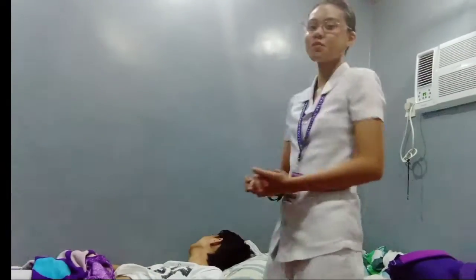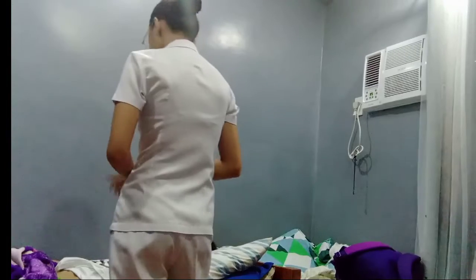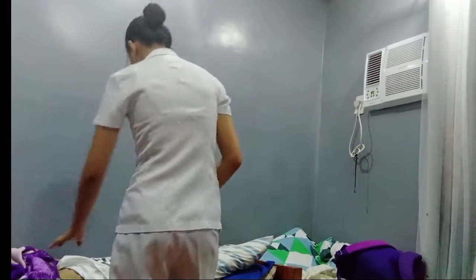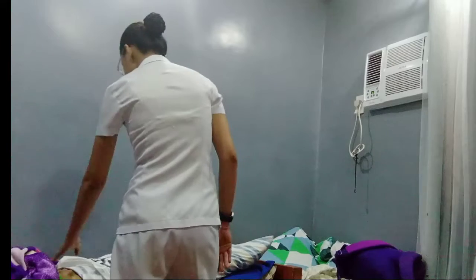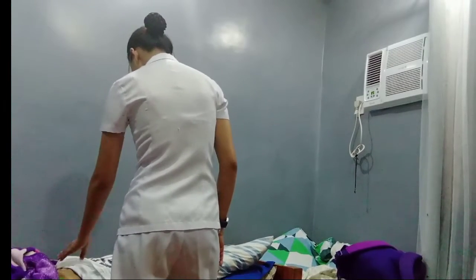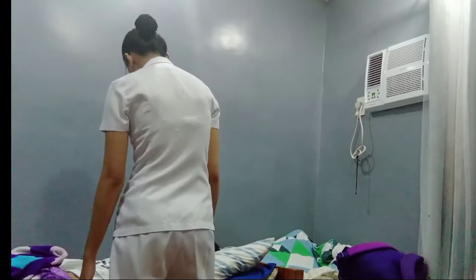Okay, thank you. Place the patient in a comfortable position and ask the patient to relax the area you're about to inject, to ensure the patient is calm and to remove anxiety. Okay, Hazli, I want you to stay calm. I will be injecting here at your abdomen, so to avoid you getting anxiety. So this is the area that I will be injecting. Okay? So I hope you can relax. And are you in a comfortable position?